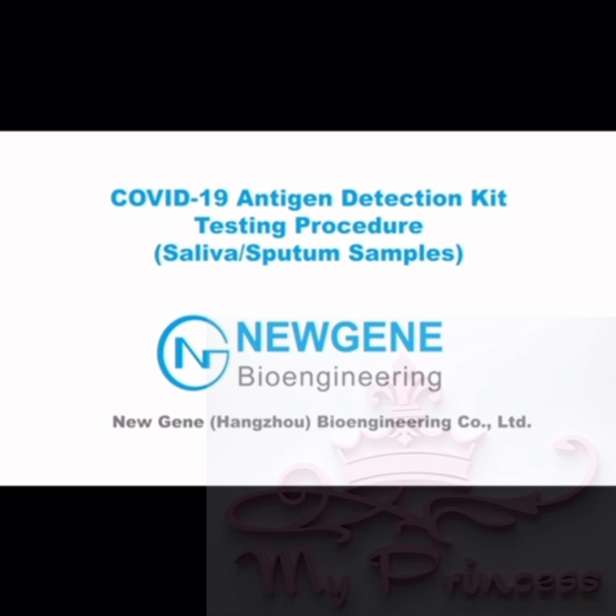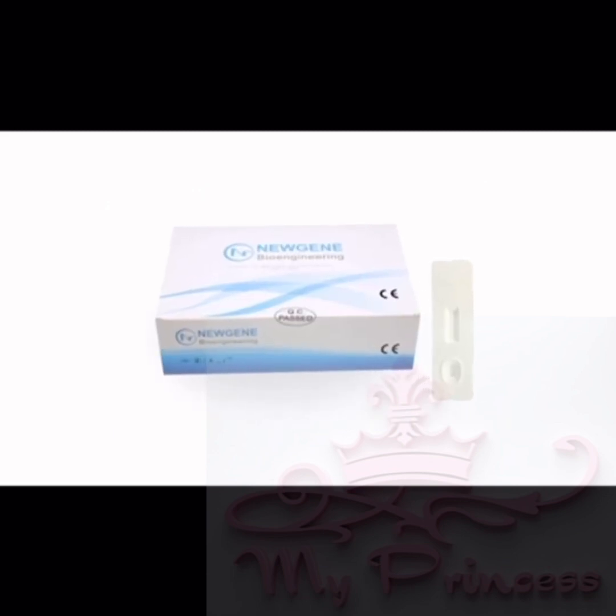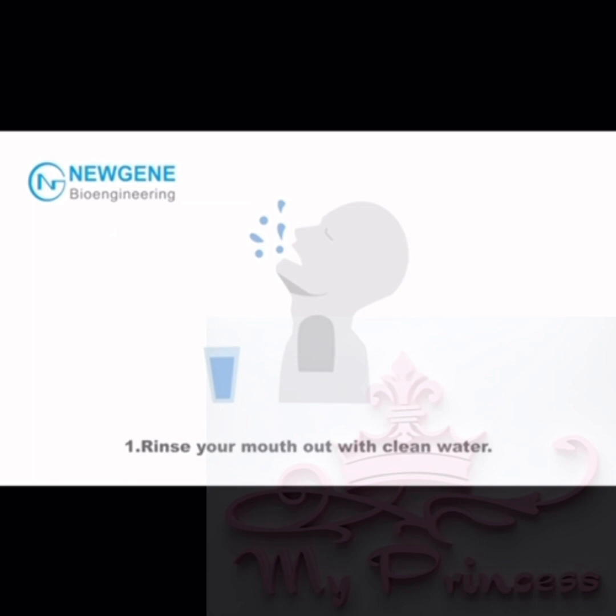Saliva and/or sputum samples. Product Composition: Test Card, Tube Cap, Paper Cup, Sample Extraction Tube, Dropper. Step 1: Rinse your mouth out with clean water.